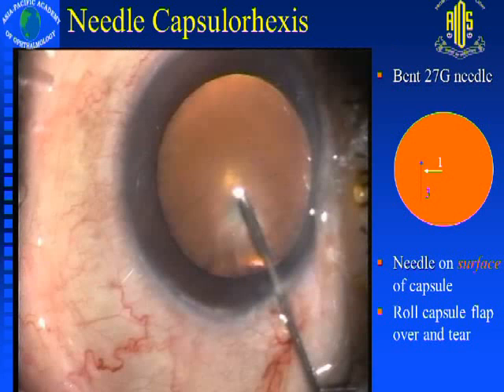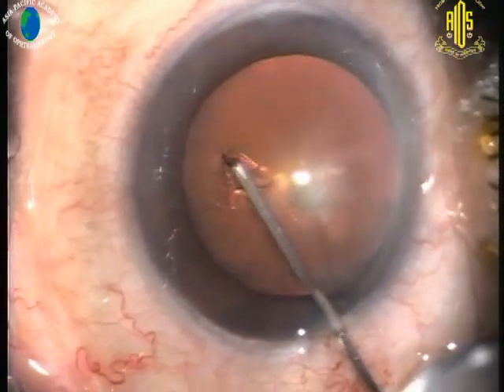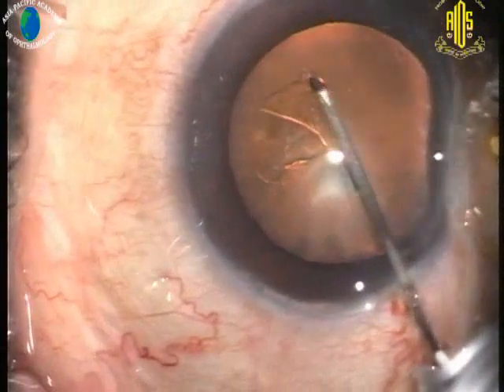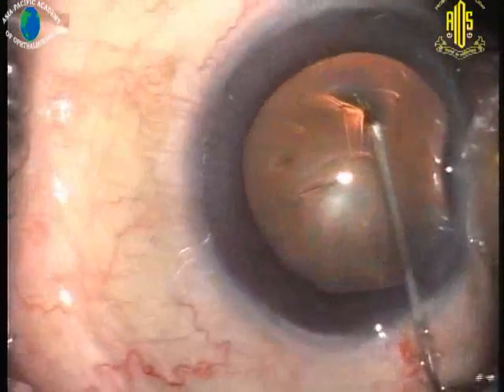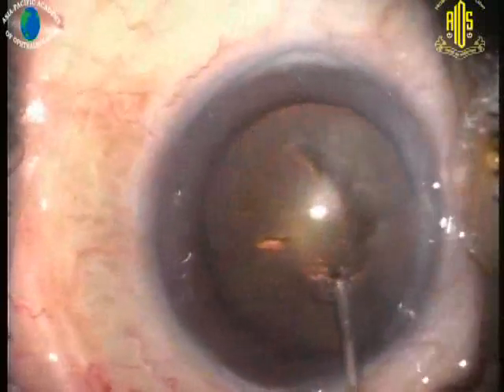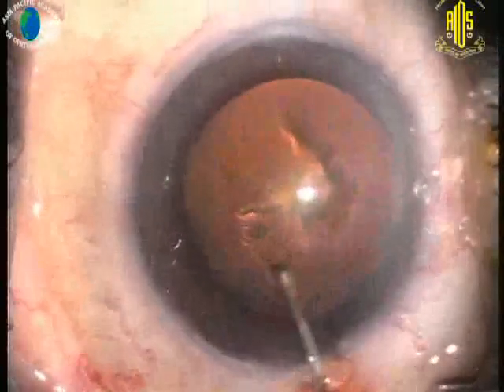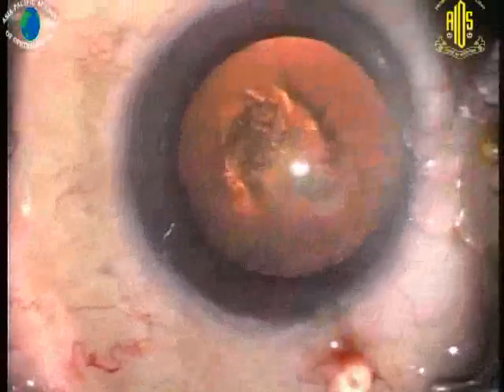You can see here a needle capsulorhexis, which most of us would probably start with as we convert from extracapsular or small incision cataract surgery to phacoemulsification. What is important when using a needle is the way it is bent — at 45 degrees — with the bevel facing upwards rather than vertically, as we do a tin can. You must stay on the surface of the lens so that you don't dig into the cortex and impede your view. The initial step is to gently puncture the capsule and use the bevel to slice the anterior capsule, then push to bring up that flap.